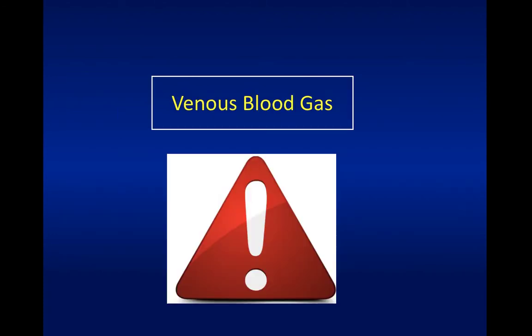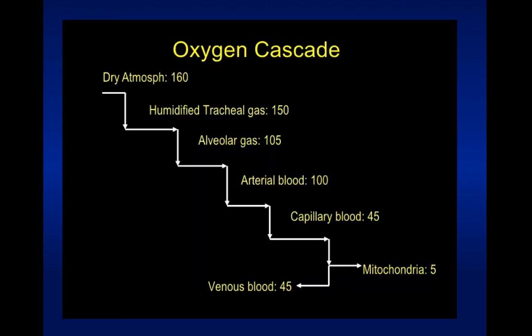We've already mentioned venous blood gases. So just be careful. You can't really assess this in a venous blood gas. So we're going to get on to all the points that Graeme has raised.